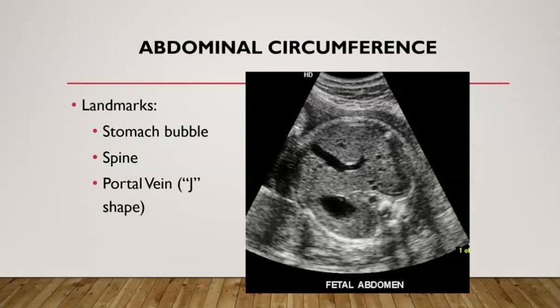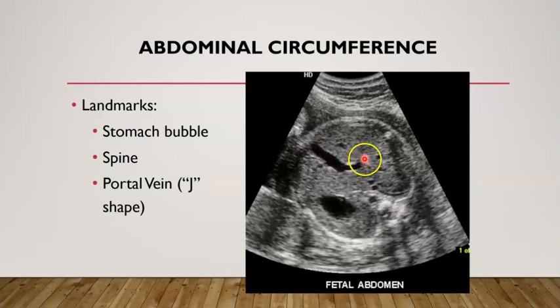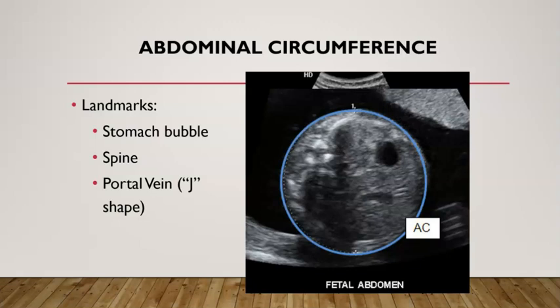Abdominal circumference is going to be measured in the transverse plane at the level of about the baby's belly button. We're going to include three landmarks: first is this anechoic structure, the baby's stomach bubble; second, the fetal spine; and third, this anechoic J-shaped structure, which is the portal vein. Once you're at the correct level with the landmarks, you want the abdomen to appear as circular as possible — an oval shape indicates an oblique cut, which is going to give you a false measurement. Just like head circumference, we use an ellipse to measure around the fetal abdomen, and you're going to include the skin line.